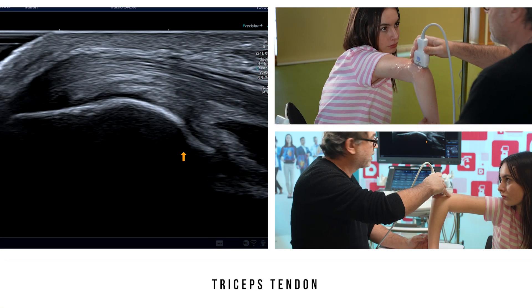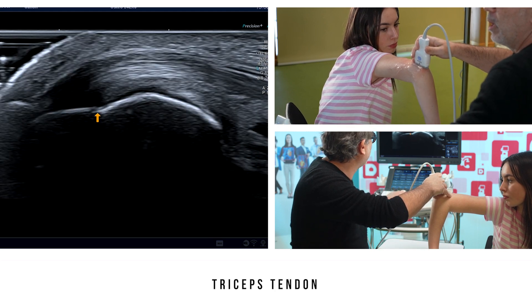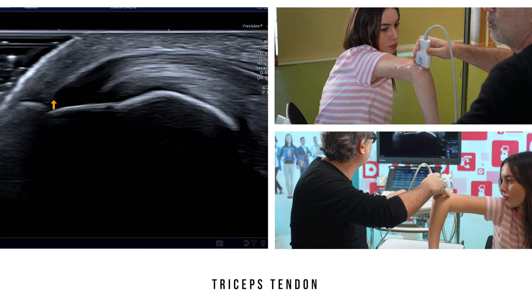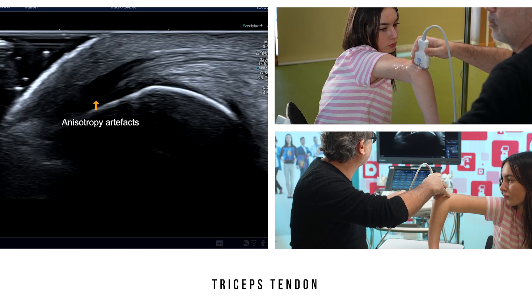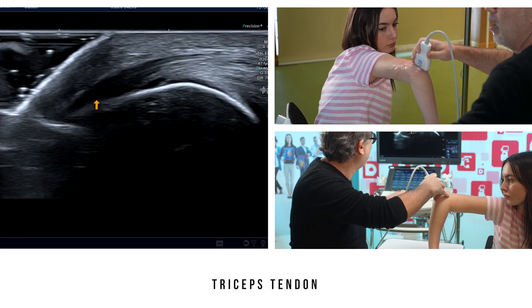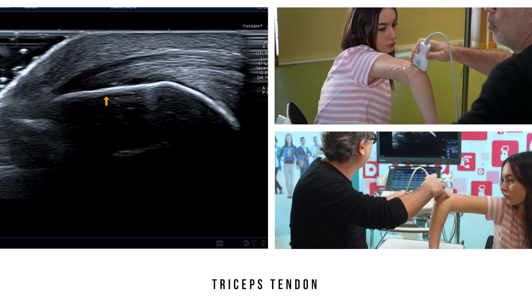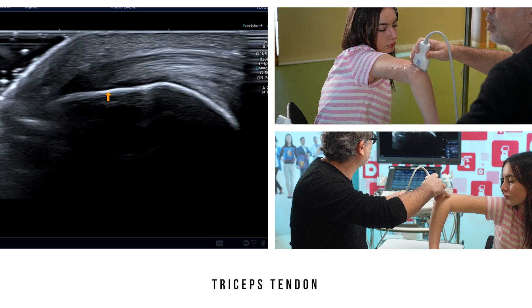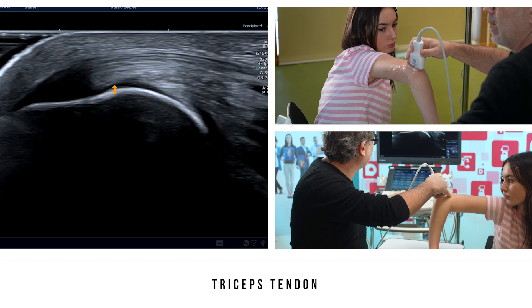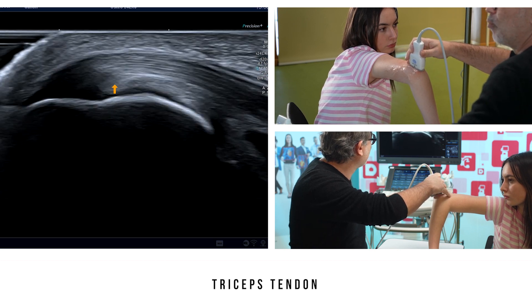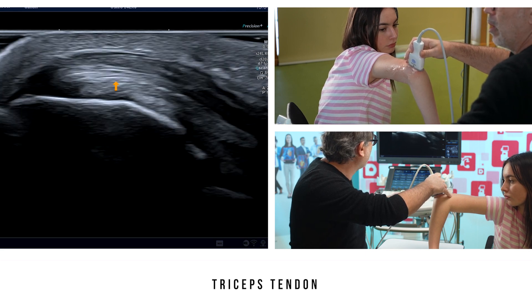Next, we can investigate the triceps tendon using a sagittal section. Its insertion on the olecranon may appear hypoechoic, but this is solely due to anisotropy artifacts. If you gently tip the probe to change the angle of attack of the sound waves, the tendon's normal morphology and echogenicity will reappear. This tendon has a fibrillar appearance due to the interposition of tendon and fatty layers, giving it a laminated appearance.